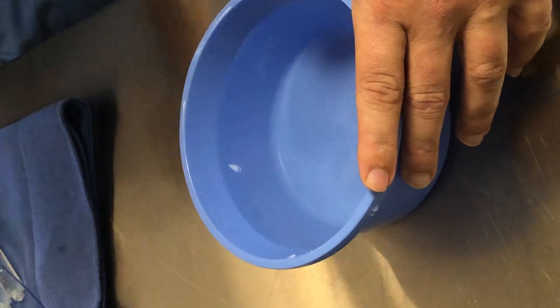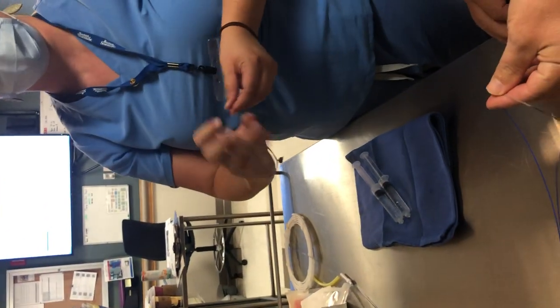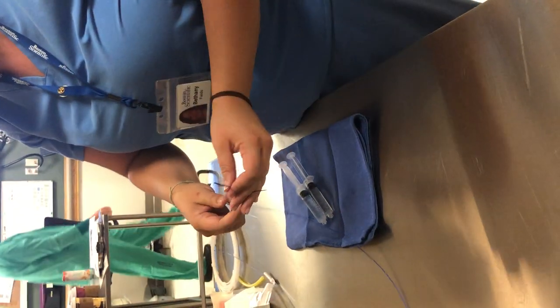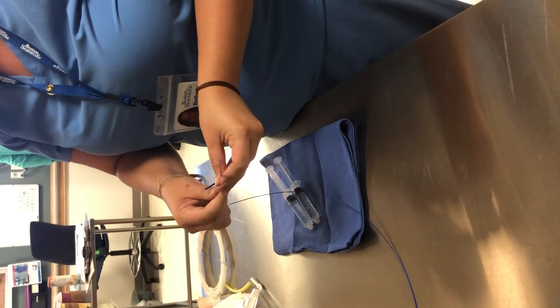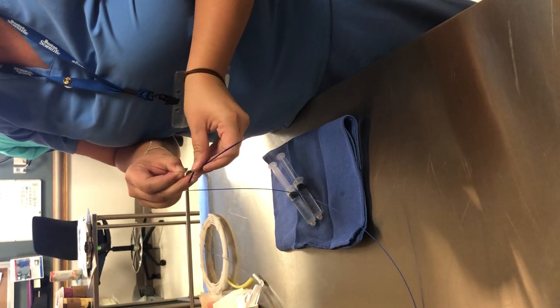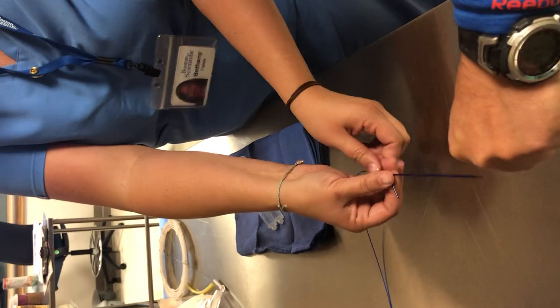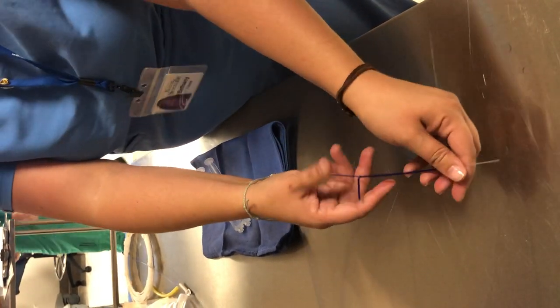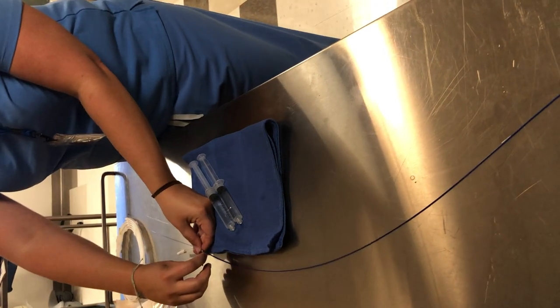Now this is ready to go into your catheter guide, or whatever you're using. There's a peel-away and your hemostatic valve, so it gets beyond the valve. Feed this in through, and then this just peels off.